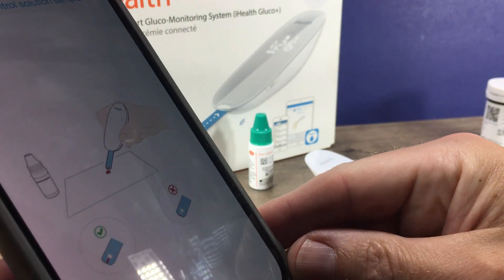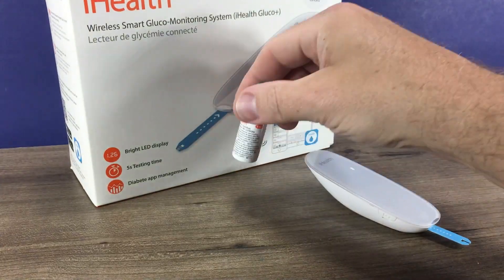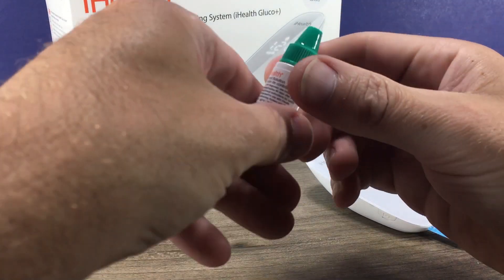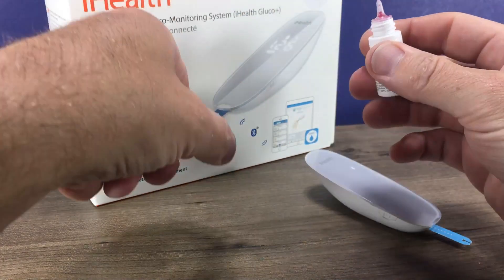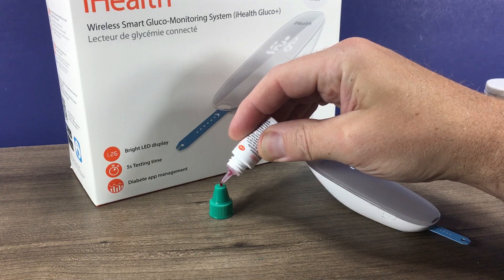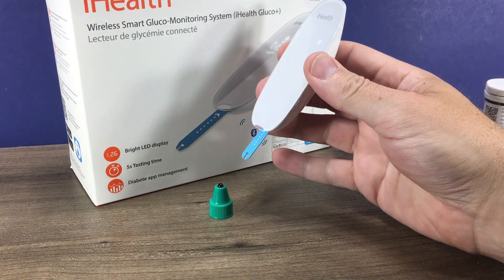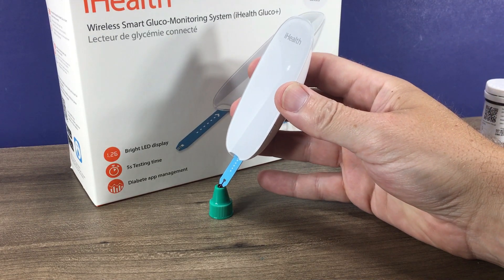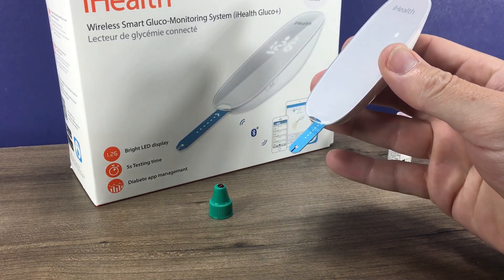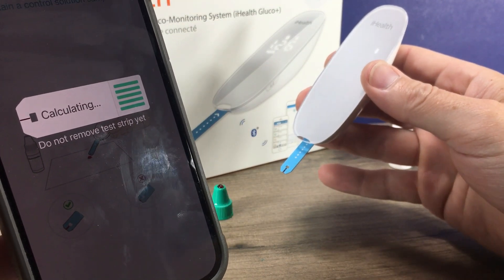Then it's going to prompt you to use the control solution. What you do is you just shake that bottle up well, and then you want to put a drop on a piece of plastic — the top of the lid generally works well for that. And just like you're doing a glucose reading, you touch the test strip to it. And then our app is telling us that it's calculating.